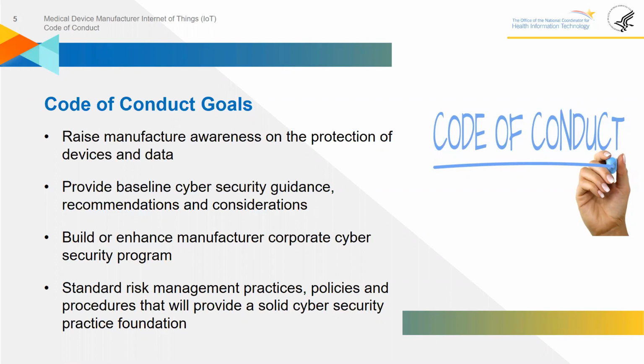Another goal is to elevate the importance of cybersecurity. We hope that the Internet Code of Conduct helps raise cybersecurity awareness for device manufacturers and helps motivate manufacturers to consider cybersecurity throughout the device system development lifecycle, meaning from pre-market considerations to post-market considerations.